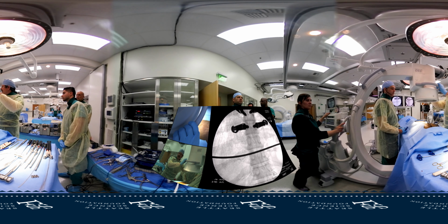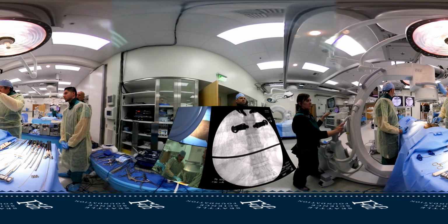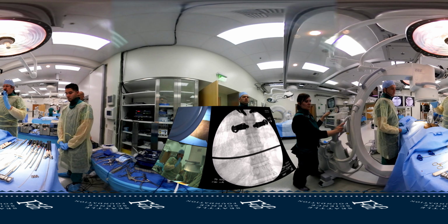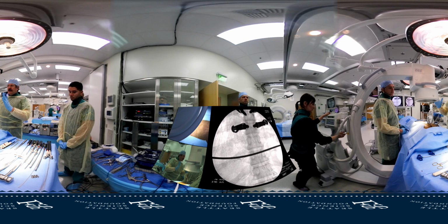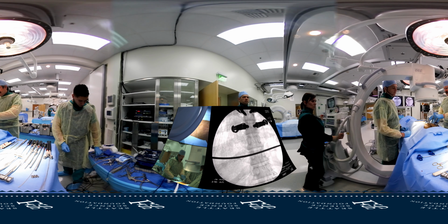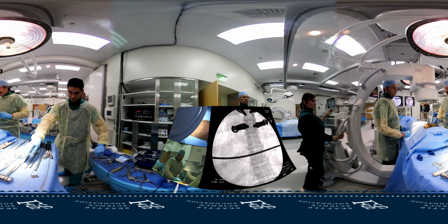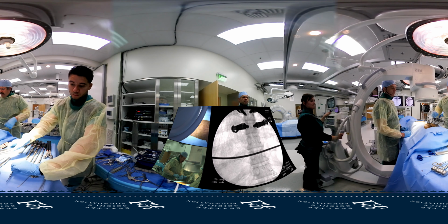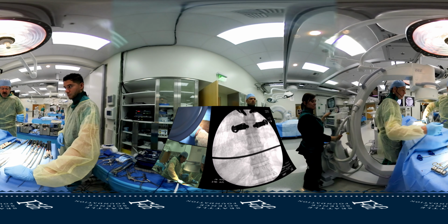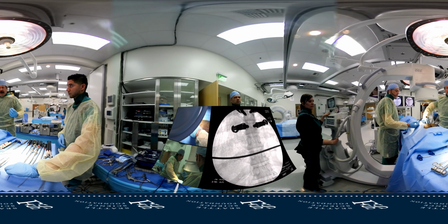So typically what I will do is I'll lay a metallic object and I'll get an AP image. Okay, and so you can see I have my screws above, and I'll adjust this down a little. And I'll get a true AP. So I'll use my tilt to get my end plates lined up, which we've already done. And then once I have that, I'll mark the skin with a marker. I like to start my holes. I want to minimize my fluoro, so I don't make a lot of pictures.